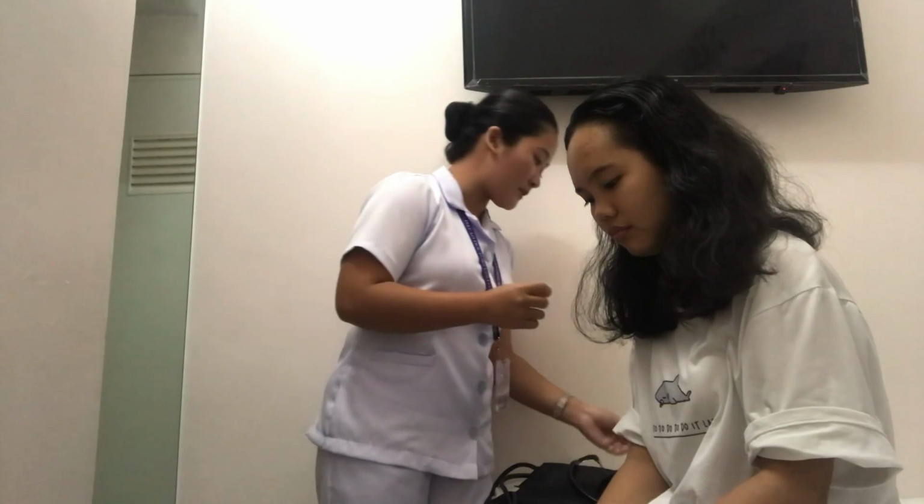So now I'm going to disinfect the thermometer I used and place it back. And after that, I'm going to perform hand hygiene, document the data that I gathered, and plot it on the patient's TPR.